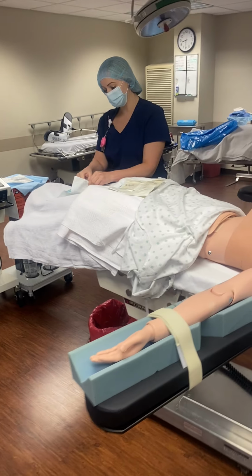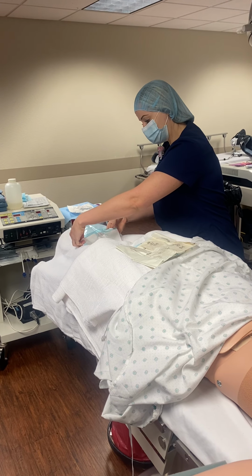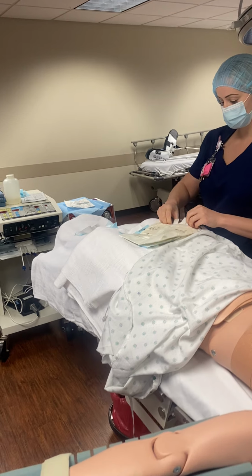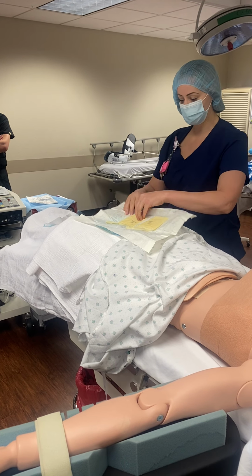So it comes in a kind of how the scrub brush comes. It's going to be in a packaging that is just the size of that brush. So when you open it, sometimes you can have someone open it to you. If they're going to have it off the field, they'll just tuck the top under and then they'll open glove.